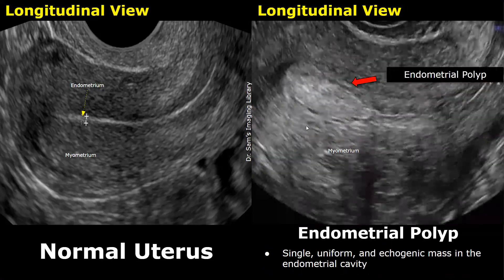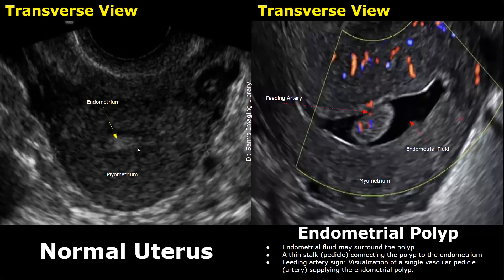This is another case of an endometrial polyp — we see a hyperechoic uniform mass occupying the endometrial cavity. Now we have transverse views of the uterus. This is the normal uterus in transverse plane, and here we have an endometrial polyp where the mass is surrounded by anechoic endometrial fluid.